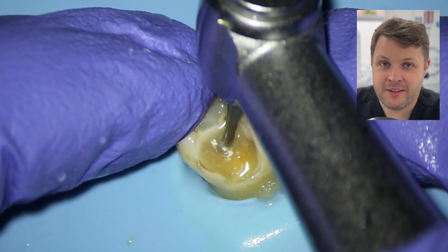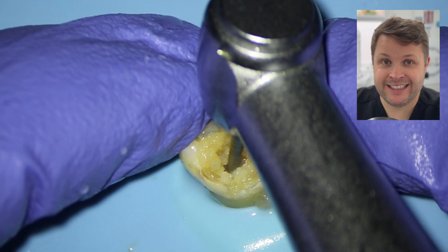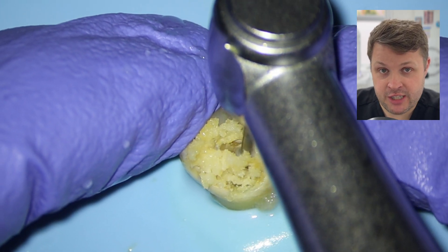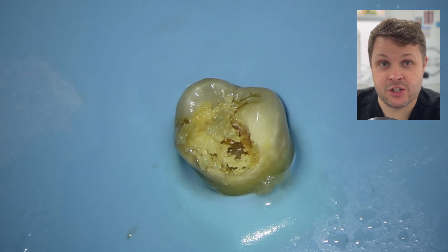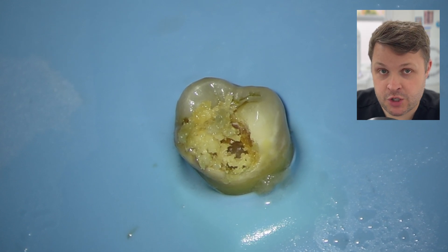I'm going to use a rose head. The great thing about these rose heads in a slow handpiece is they don't remove hard tissue very well. This might be blindingly obvious to an experienced dentist, but if you're new to this — the rose heads don't really get rid of a lot of hard tissue. So in that case, all you are removing is the soft dentin underneath.